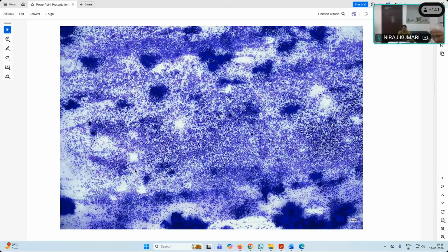So, Dr. Dakshayani? Yes, ma'am. Would you like to comment on the smear? Highly cellular smears, ma'am. In low power, the cells are arranged in small sheets and clusters, as well as discretely present. Predominantly blue cells are seen. Okay, so they are mostly discohesive cells, and then there are some of these cohesive clusters.